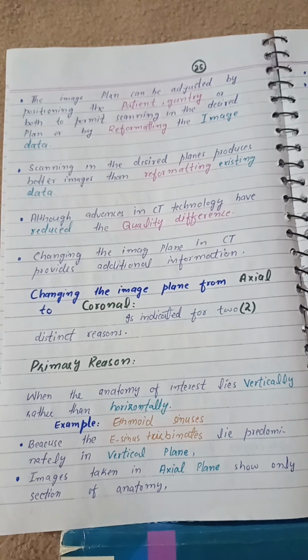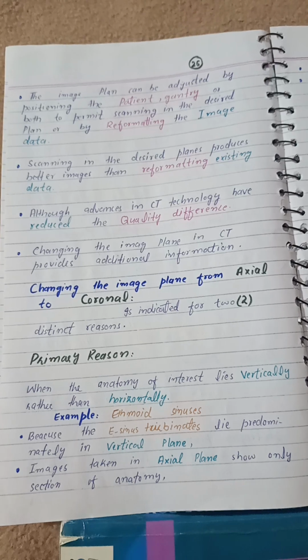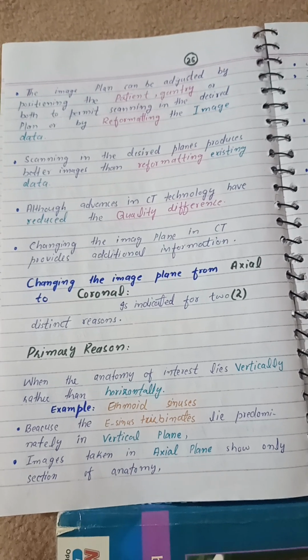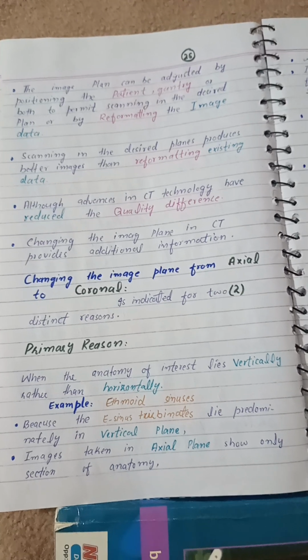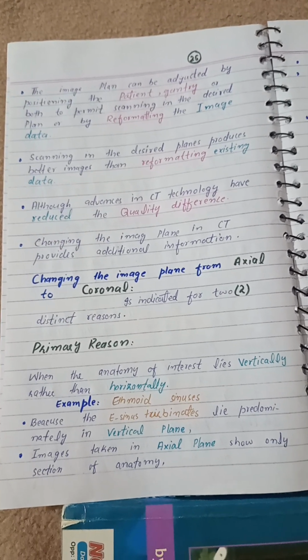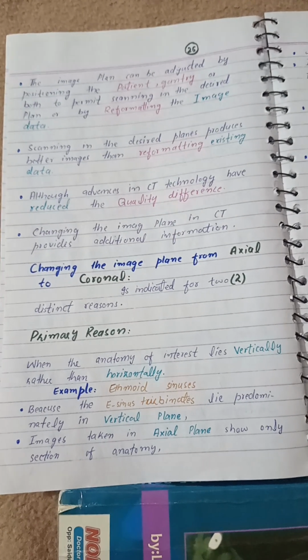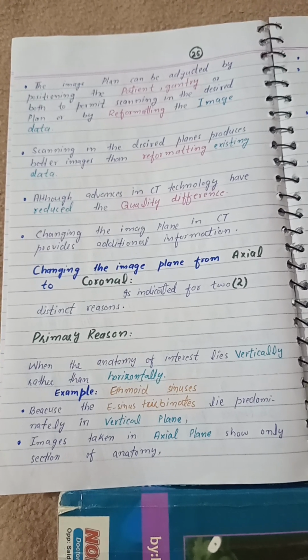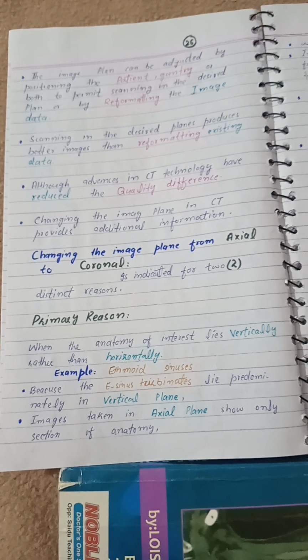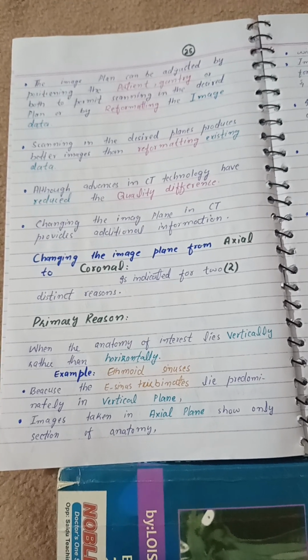Scanning in the desired planes produces better images than reformatting existing data. Although advances in CT technology have reduced the quality difference, changing the image plane in CT provides additional information. Changing the image plane from axial to coronal is indicated for two distinct reasons. The primary reason is when the anatomy of interest lies vertically rather than horizontally.